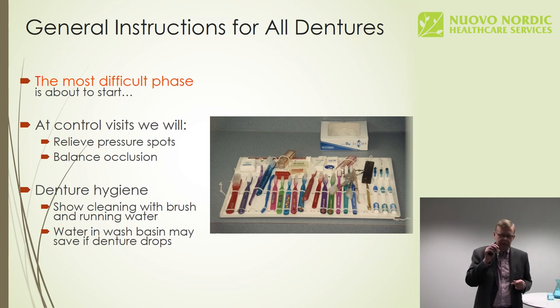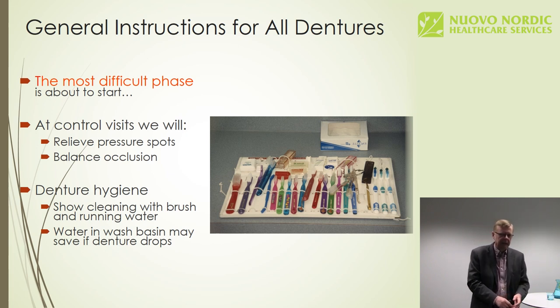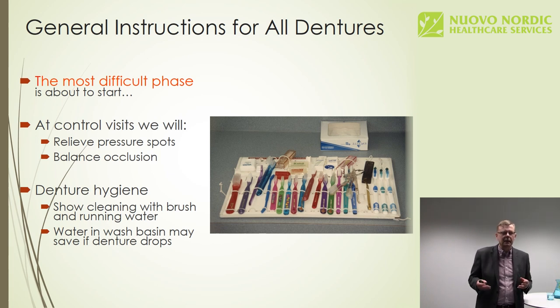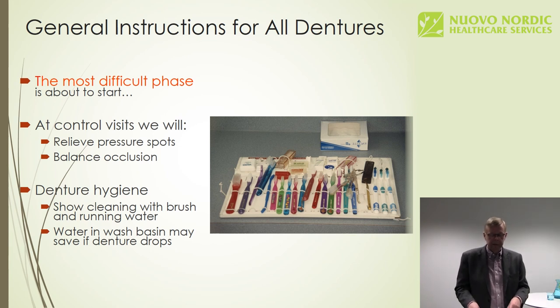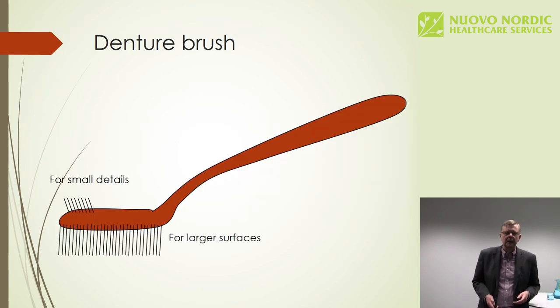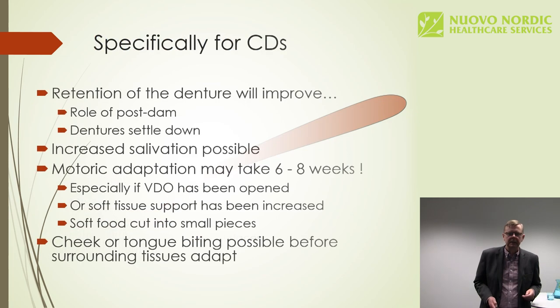You have to show the patient how to clean the dentures, a fixed denture in the mouth, removable denture, how you brush the inside of the denture in your hands under running water. If you want them to use any cleaning tablets or materials, cleaning paste, you should show the patient. By the way, it's a good idea, when the patient is brushing the denture, to have some water in the wash basin, so that if the denture drops, it will drop into water and not on the floor or into the dry basin and break. So anyway, we'll give the instructions. A denture brush, in case of removable dentures, it's a good investment.